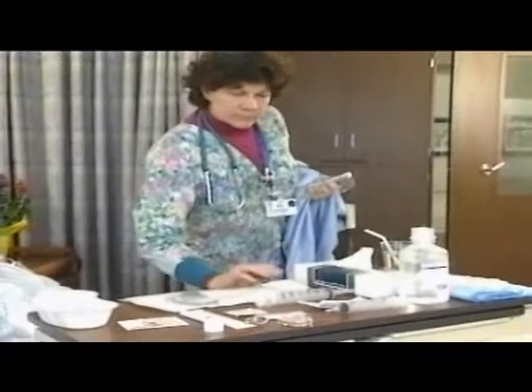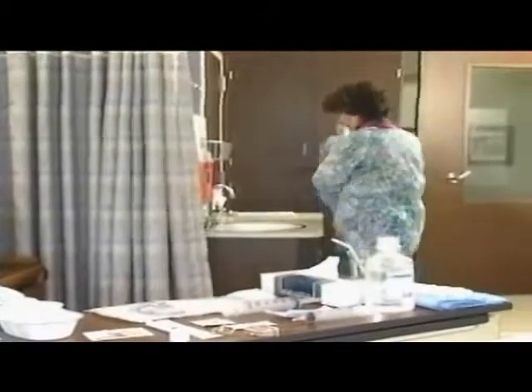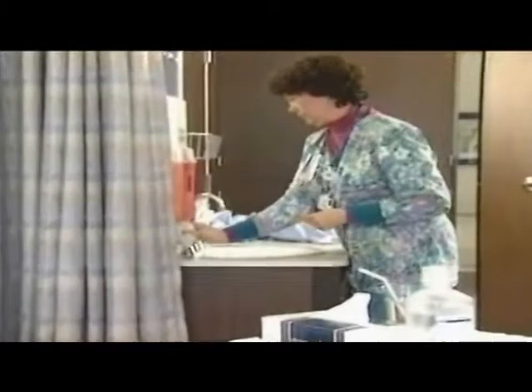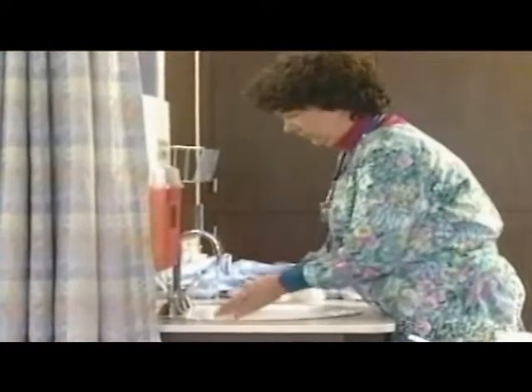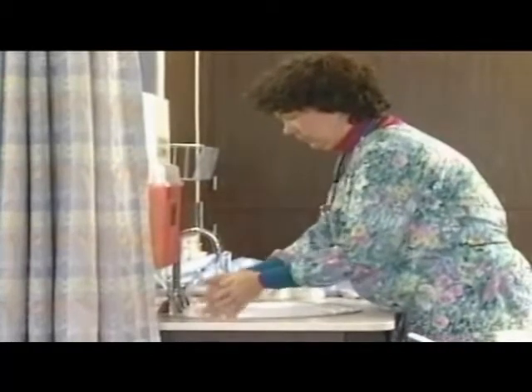The tube used in this procedure is a Salem sump. The doctor ordered this tube for decompression. Wash hands before and after all nursing procedures.